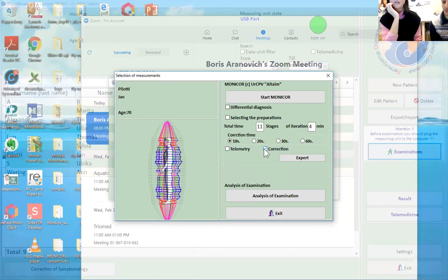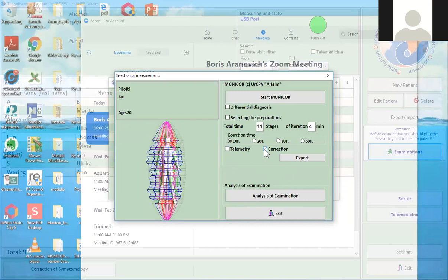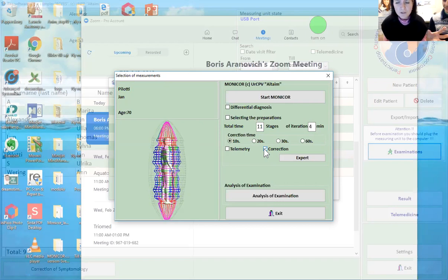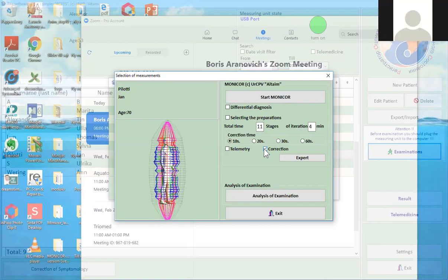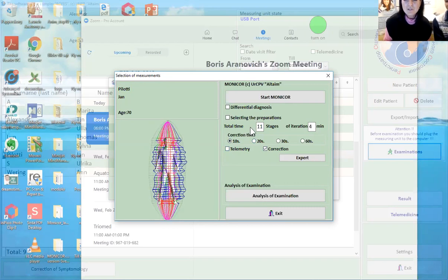I actually don't use it, and it's really complicated. Why should you send it to some kind of doctor to ask something? It's like they were doing it between each other when they were working with these frequencies, but you actually don't need it. So this one, 10 seconds, 20 seconds, telemetry, just ignore. Just do this time, and you can see expert here.